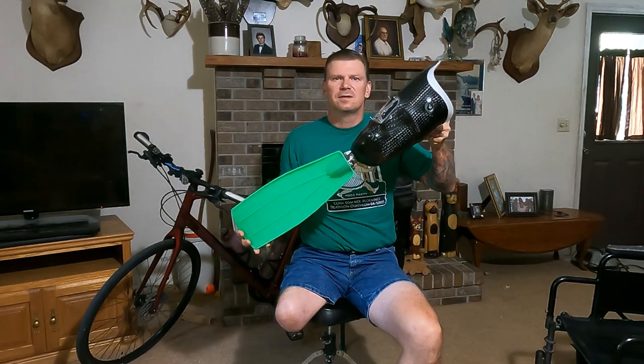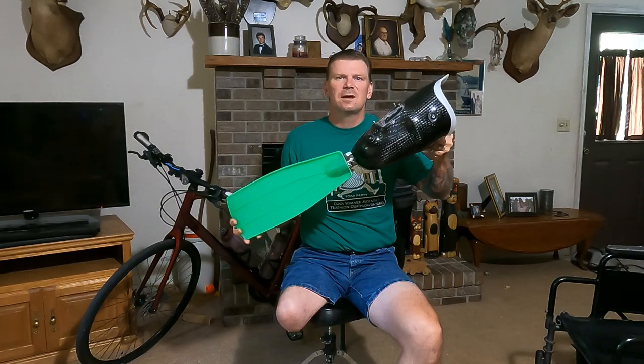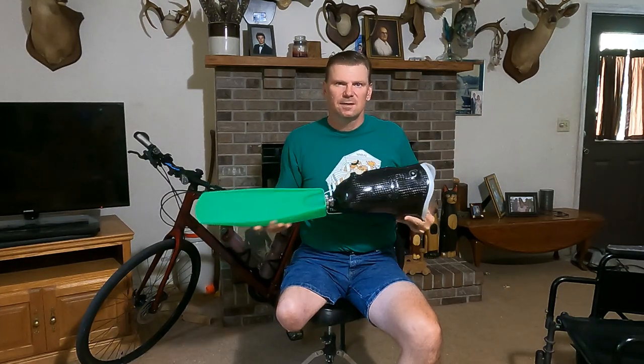Hello everybody, Michael from Amplight Photography here to give you a product review of the Amp Fin. It's a specially engineered fin that bolts up to your socket and allows you to skin dive and scuba dive. I reached out to the company and in correspondence I had the privilege to meet Randy, the owner and inventor of Amp Fin. He happened to be in Florida for a couple of weeks from Maine and he made time out of his busy schedule to come out and let me demo one and give it a try.